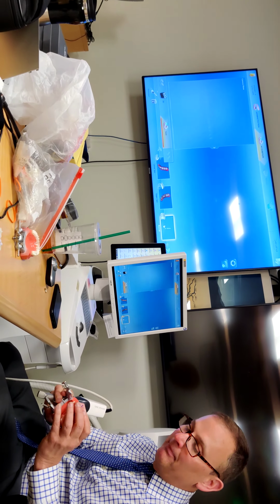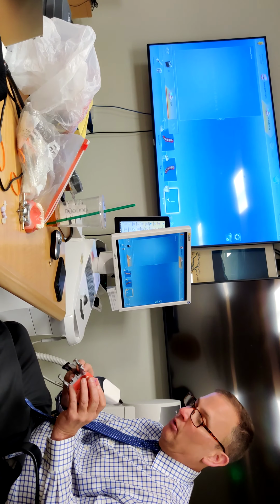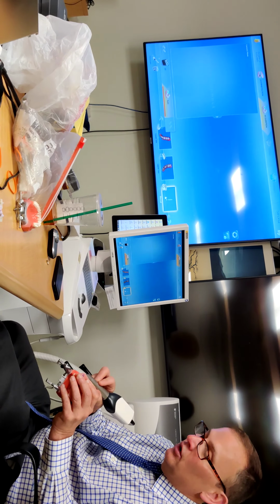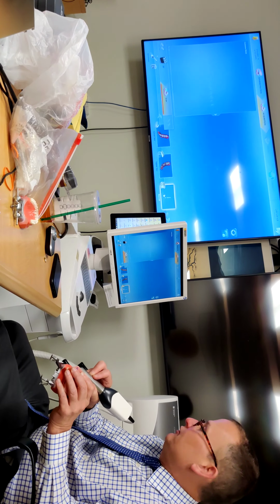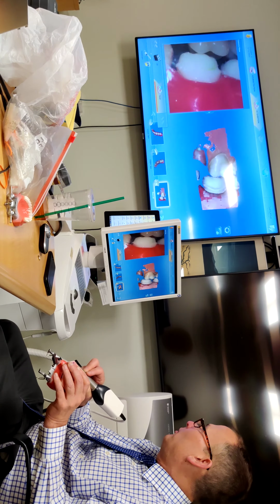Tell the patient to bite down and hold it tight. Don't open, don't move, okay? Patient, don't open, don't move. Buckle. Stay close and put it in their cheek and then scan. The important thing is that you get the free gingival margins.